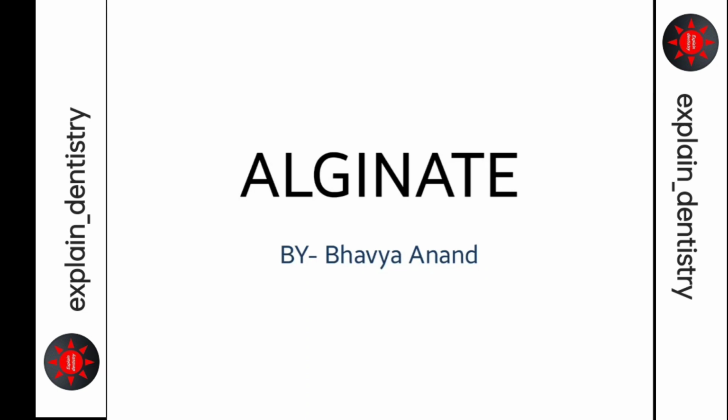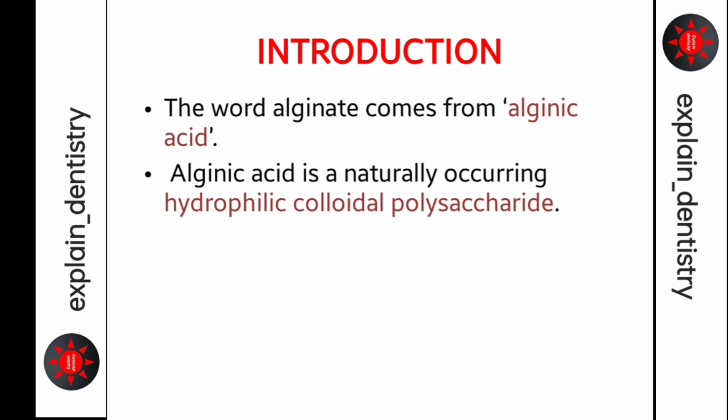Hello everyone. Today we will talk about alginate. Alginate, the word comes from alginic acid. Alginic acid is a naturally occurring hydrophilic colloidal polysaccharide.